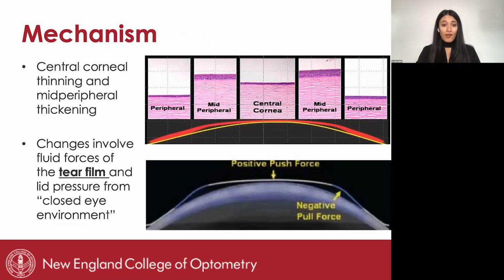So how does Ortho-K actually work? Effectively, we know there is some level of corneal curvature flattening and mid-peripheral curvature steepening, but we don't quite know exactly how this phenomenon occurs from a physiological standpoint. One theory is that the fluid within the central epithelium is compressed, so there's no loss of cells and no cells actually move, but fluid within these cells moves, and that's what gets dispersed.